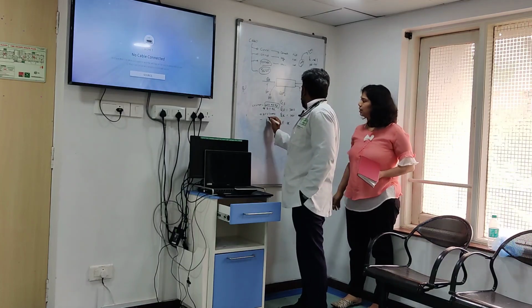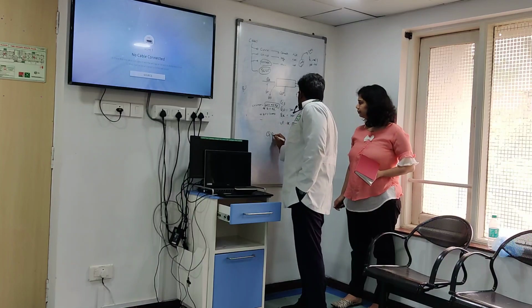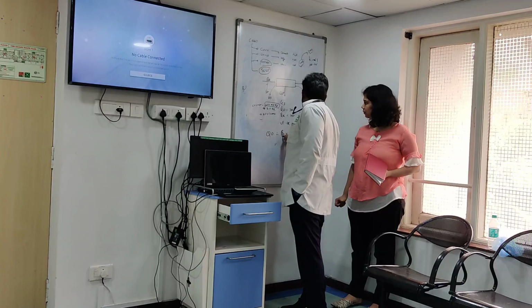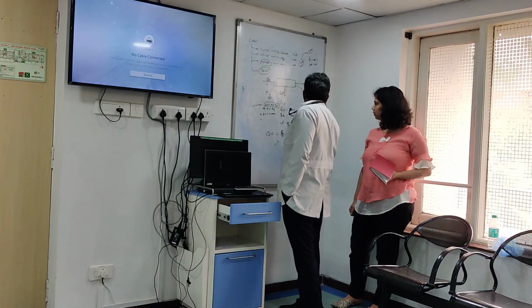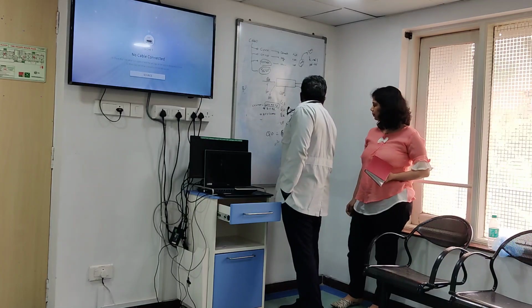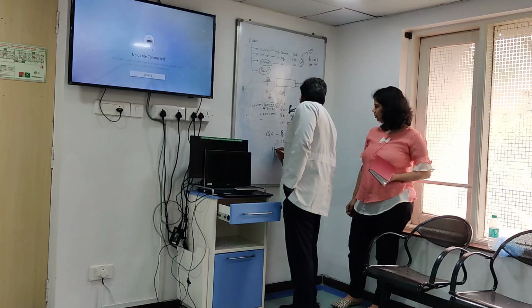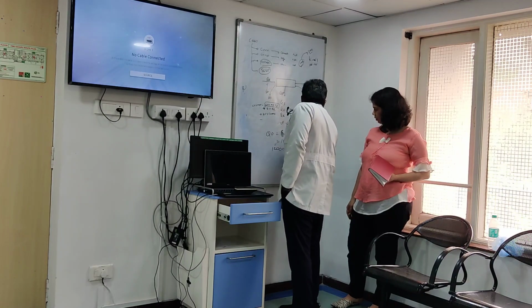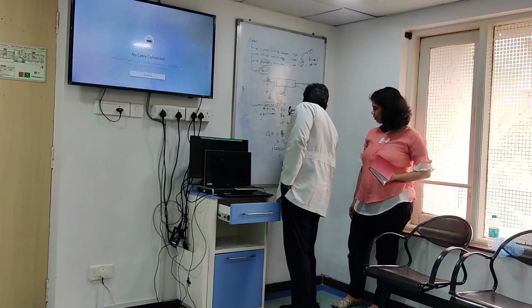So QB has to be 6 times that of QR. This is what I have to use now. 6 times QR is how much? 12,000. This is per hour, ml per hour, so 12,000 ml in 1 hour. 60 minutes, so per minute is how much? 12,000 divided by 60 is 200. 6 2s are 12.